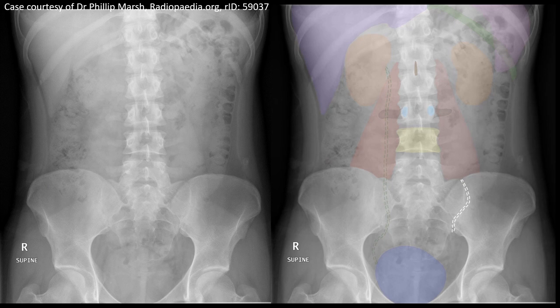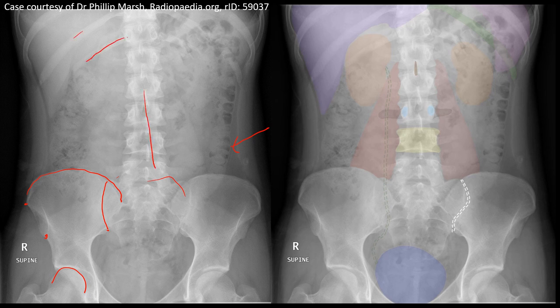This is the plain anteroposterior view of the abdominal region showing the anterior superior iliac spine, anterior inferior iliac spine, iliac crest, posterior superior iliac spine, posterior inferior iliac spine, sacroiliac joint, head of the femur, sacrum, coccyx, as well as the vertebrae, ribs, and soft tissues like liver, spleen, kidney, muscles, large intestine, and small intestine, without any visible abnormality.